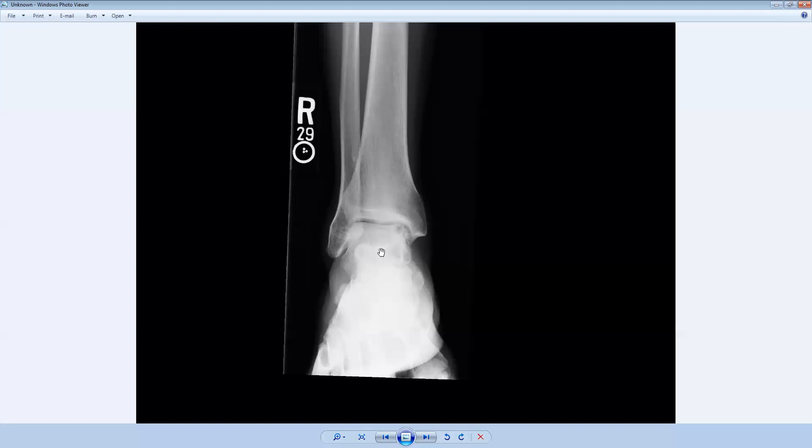Well, the talus isn't a long bone, number one. And number two, usually a chondroblastoma occurs when the physes are still open, the growth plates are open. Here you can see the physis has closed. You can see this is the physeal scar here along the distal tibia. So making chondroblastoma much less likely.